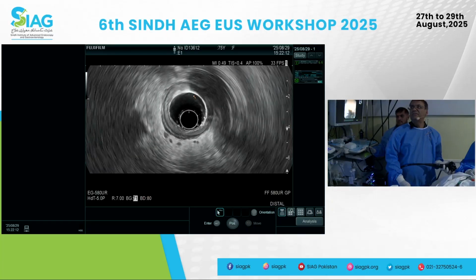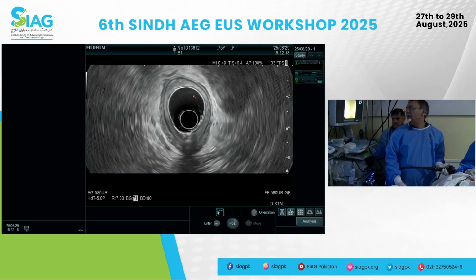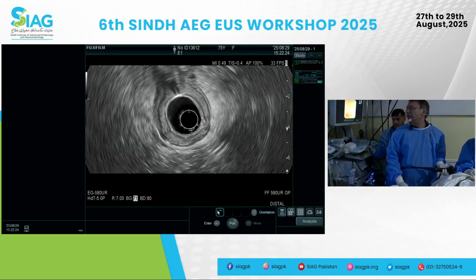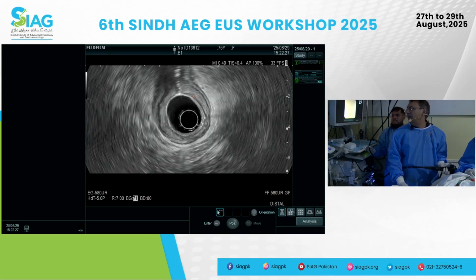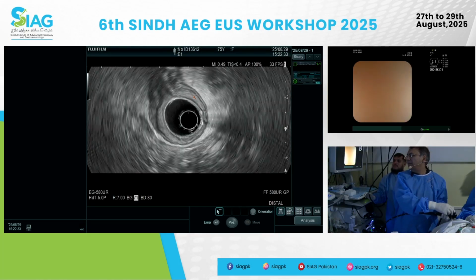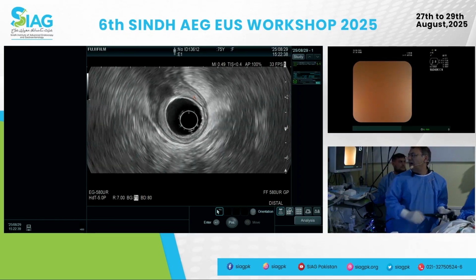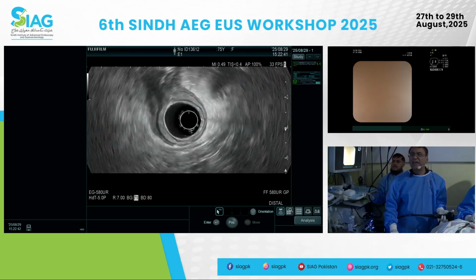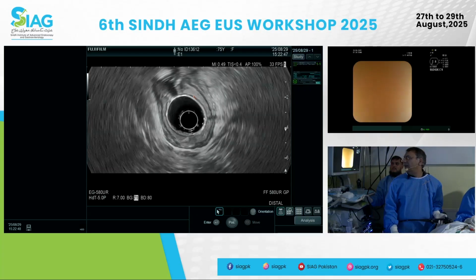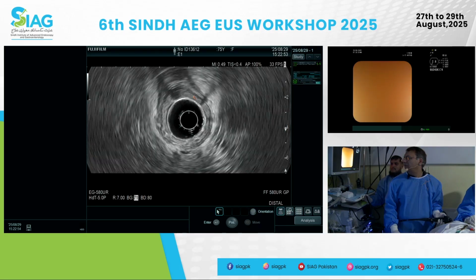It's right at the bottom. You see a little bit of mucosal thickening, but the muscularis itself is really well preserved. There's some thickening of the submucosa, but I don't see any mass. I don't see any major lymph nodes, whatever we are looking at, honestly. It does not look like a tumor or anything. I think it's just ulcer inflammation there. Right here, you see a little bit of thickened wall itself.